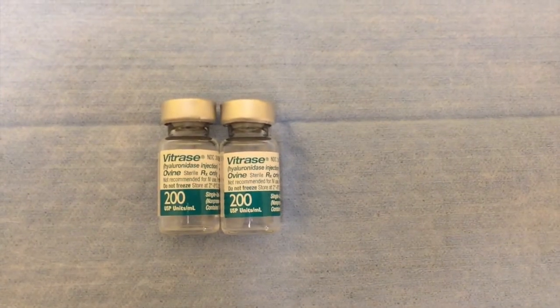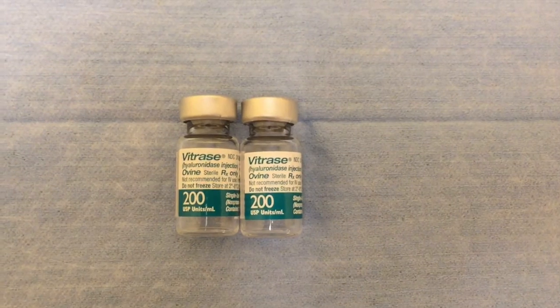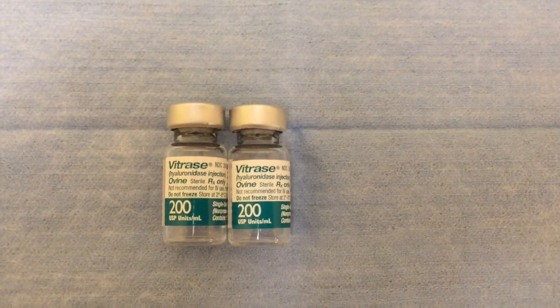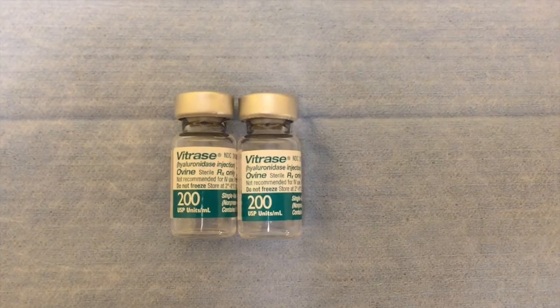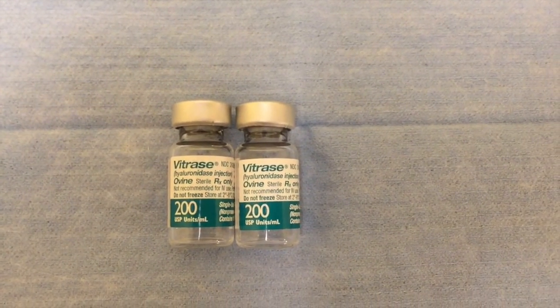Today we're going to use Vitrase to dissolve some hyaluronic acid from the lower lid region that was placed approximately 4 years ago in our current patient. And this is the Vitrase, comes in 200 units and 1.2 cc's of fluid, and we're going to inject 1.2 cc's in each side of the lower lid.